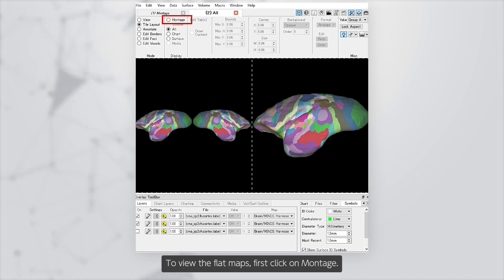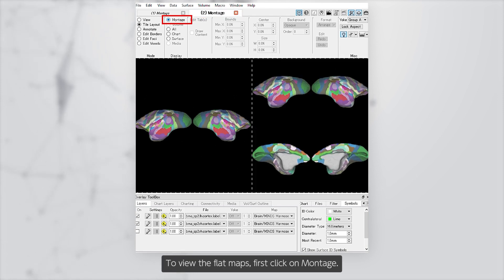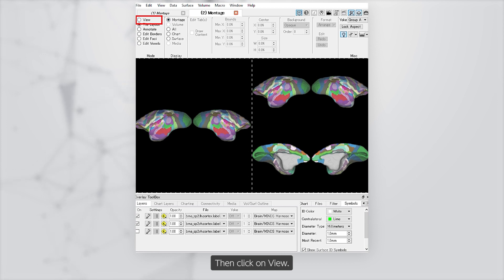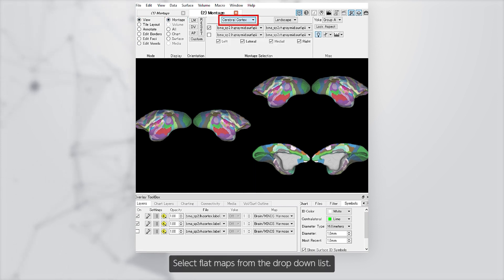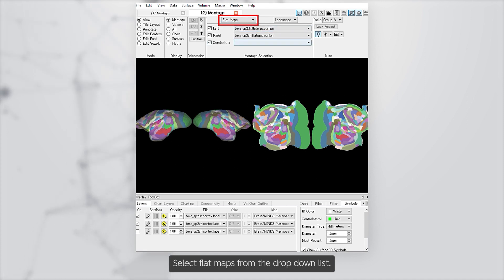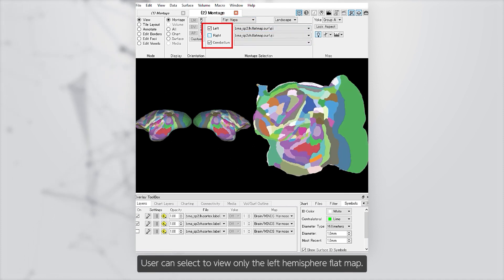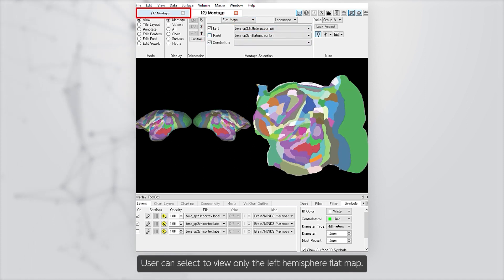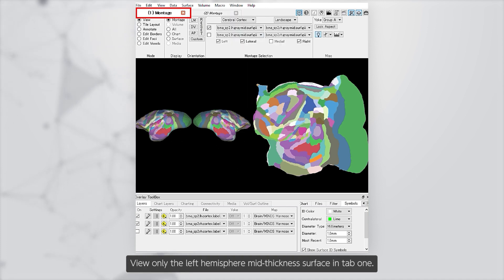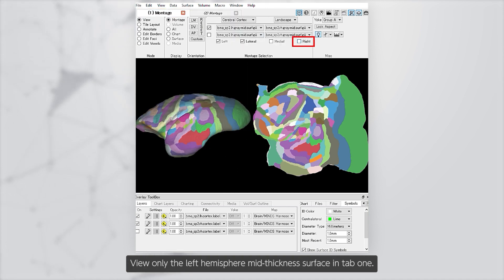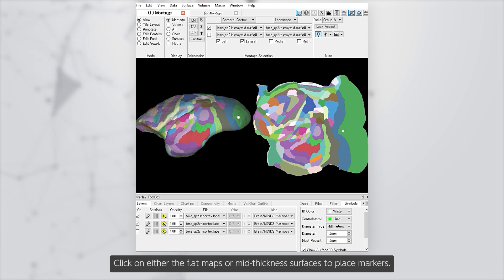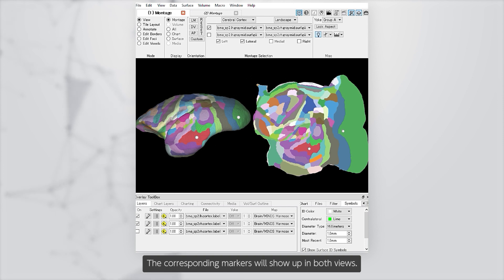To view the flat maps, first click on Montage, then click on View, and select Flat Maps from the drop-down list. The user can select to view only the left hemisphere flat map. View only the left hemisphere mid-thickness surface in tab 1. Click on either the flat maps or mid-thickness surfaces to place markers. The corresponding markers will show up in both views.